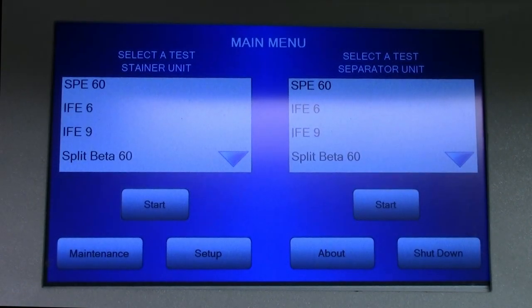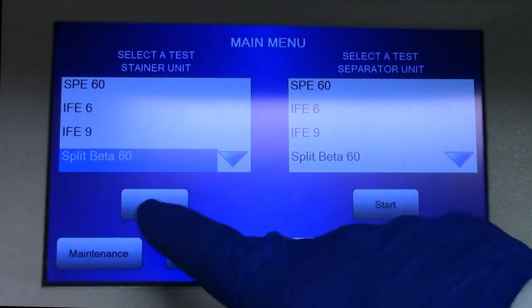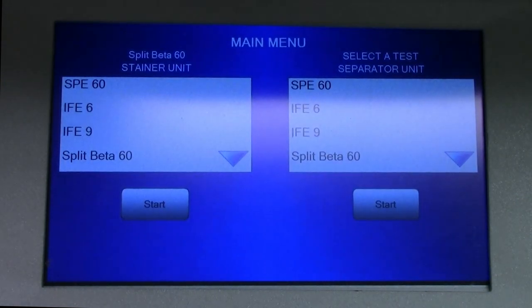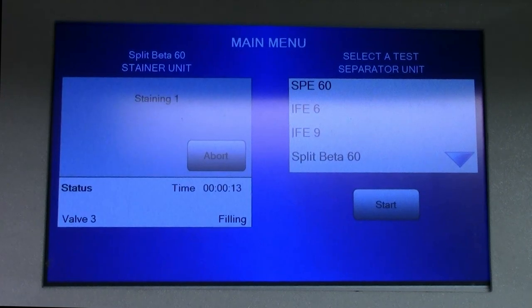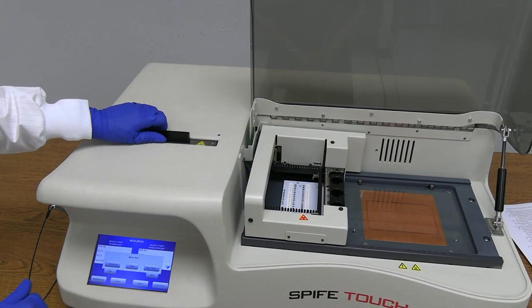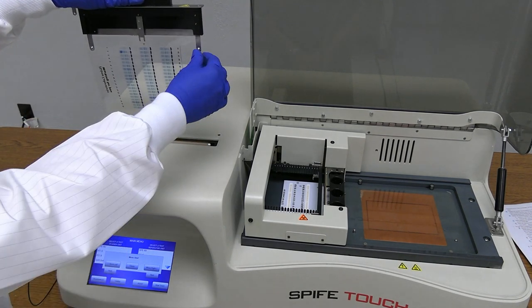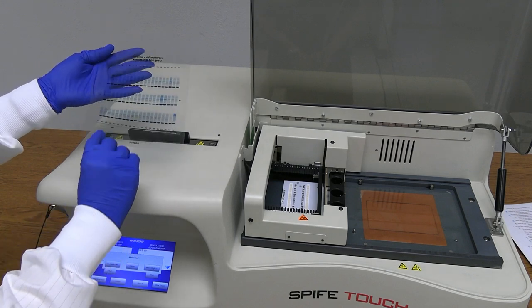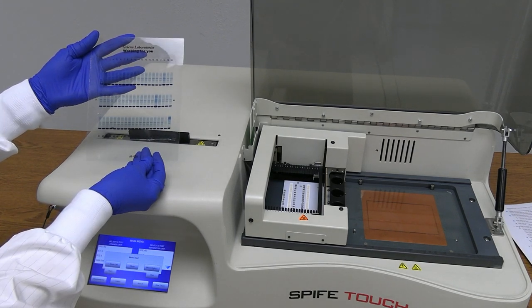Use the arrows under the stainer unit to select the appropriate test and press start. Then press start again. The instrument will stain, destain, and dry the gel. When the process is completed, the instrument will beep, indicating the process is complete. Remove the gel holder from the stainer and scan the bands in a densitometer.